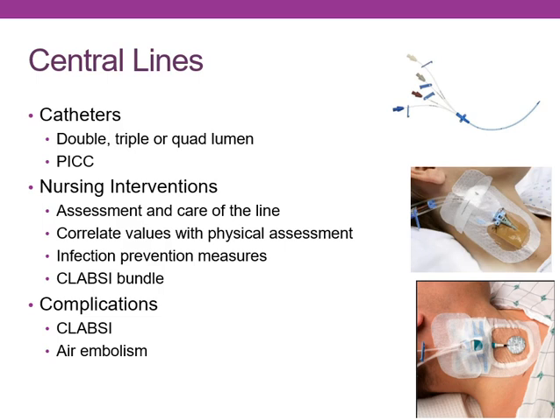Your PICC line, which can be double or triple, don't say that, so those are done by color. On this quad lumen, FYI, this gray port is your bigger port. So if you needed to give blood products, we would actually use that.